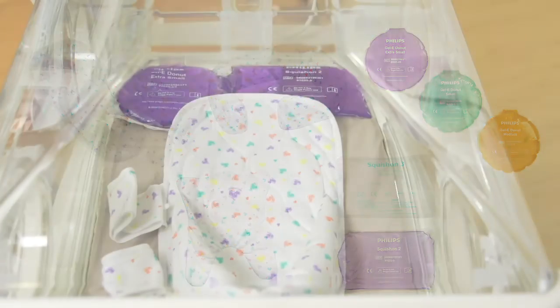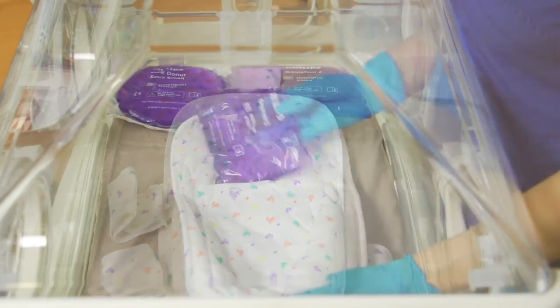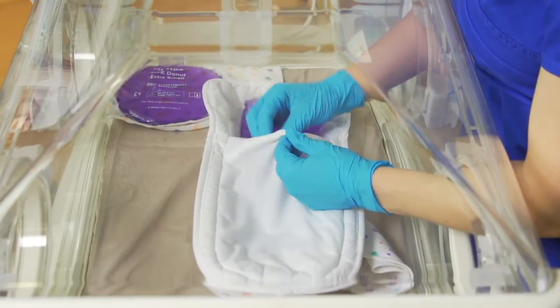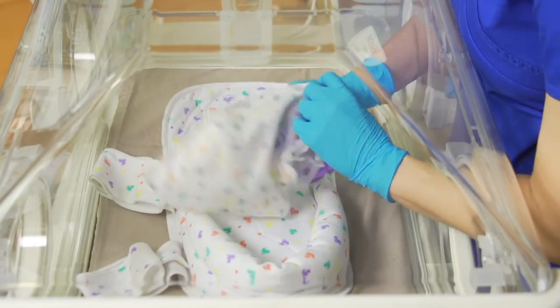For thermally unstable patients, pre-warm the gel in an incubator, under running water, or with a warming pad. Once warm, the positioning aid will remain at the approximate temperature of the incubator or the ambient air temperature of the warmer. If using a Squish-On 2 or 3, insert it into the back of the snuggle-up. Cover the gel with a disposable cover before patient use.